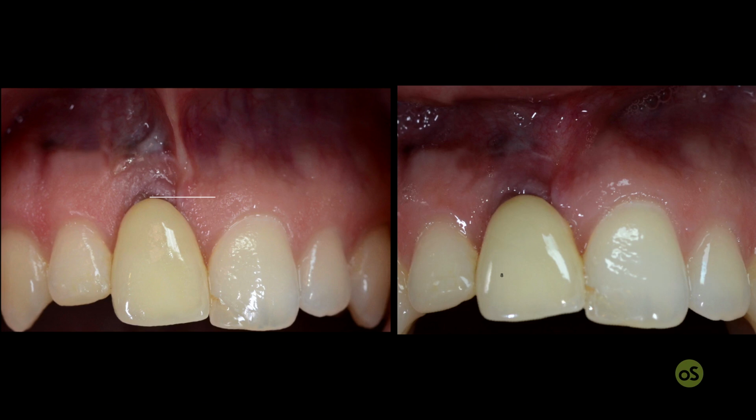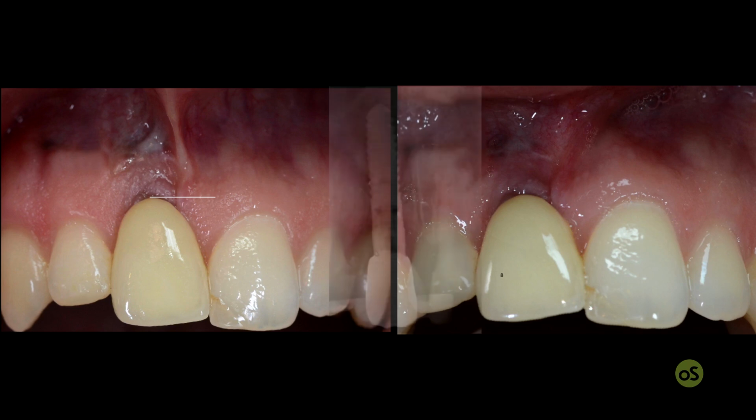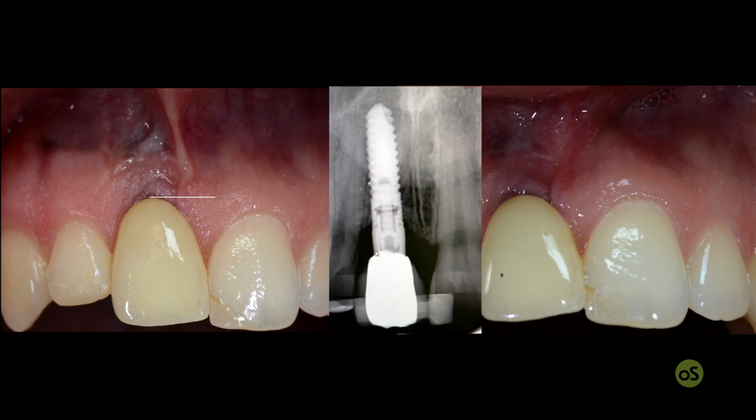When I saw the patient, there was a disalignment of the soft tissue margin and a lot of scar tissue coming in part from the previous surgical procedure that was done in order to increase the keratinized tissue by grafting. The level of the bone was not bad. The implant was placed really not so well.